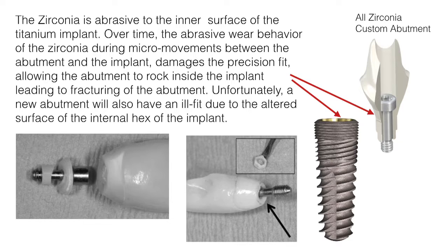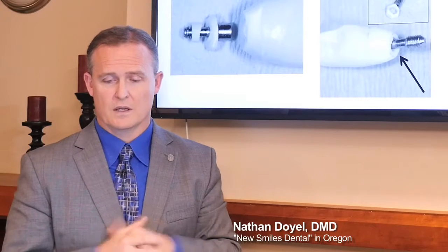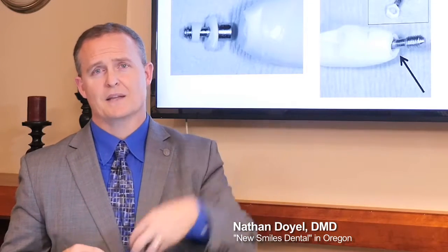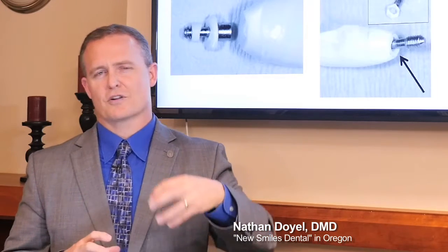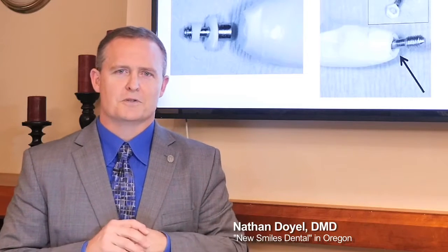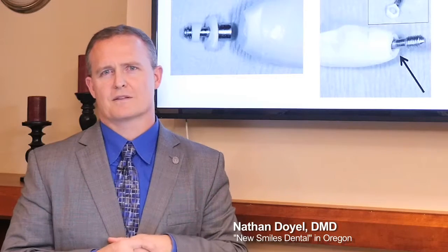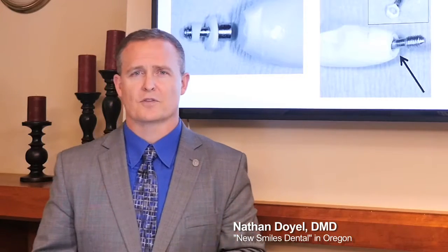That begins to allow the little shifting to occur, and then it gets off angle, and you actually end up having a breakage, oftentimes with the zirconium. And then, unfortunately, you think, okay, now I can go back and put a titanium one in place. The titanium won't fit precisely either, because the damage from the zirconium has already been done on the internal surface of that titanium. So don't use an all-zirconium abutment. If you're going to use a custom abutment that's tooth colored like that, have it with a Ti-base, some kind of insert that's titanium.